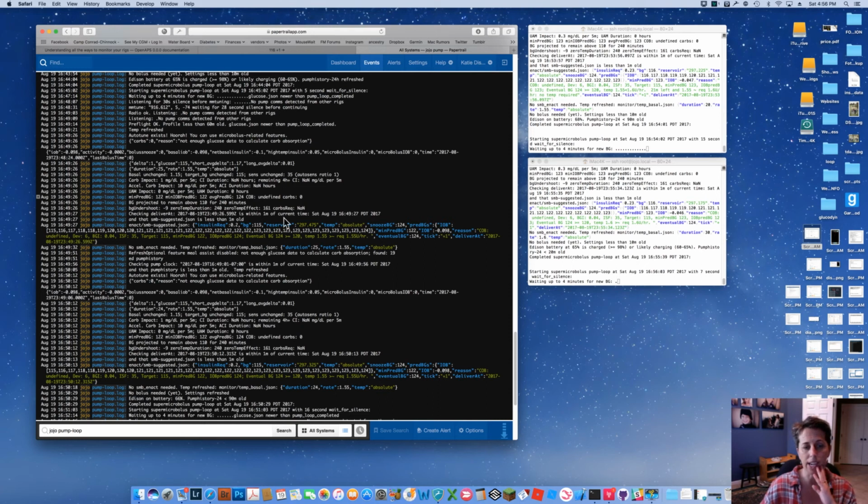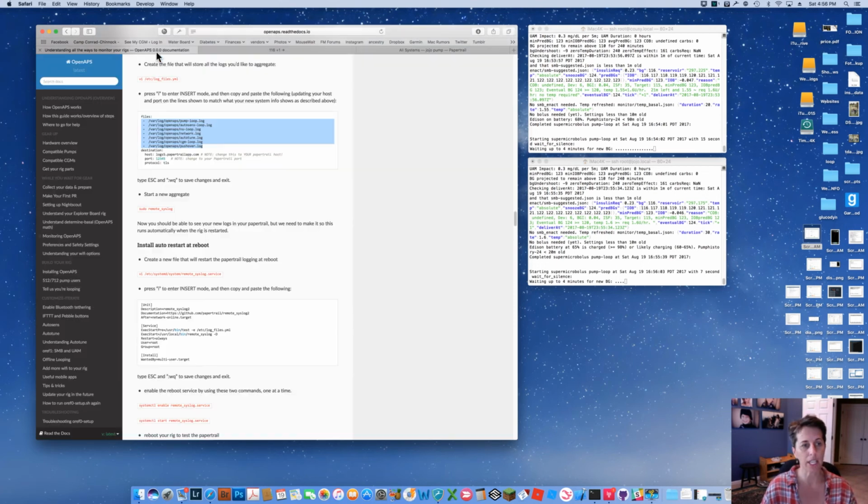I can tell you that these rigs are newly on. They've been off for a little bit. So one of the things I do notice is, if you see here, I do have one message that is kind of obvious that I have a problem. It's not really a problem, but it says carbs 0, reason not enough glucose data to calculate carb absorption. That's in the documentation for new pump loop users.